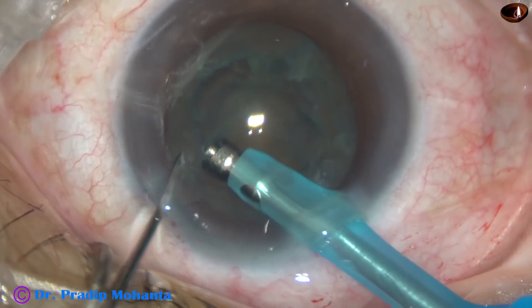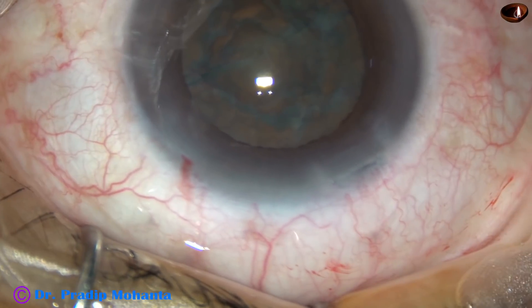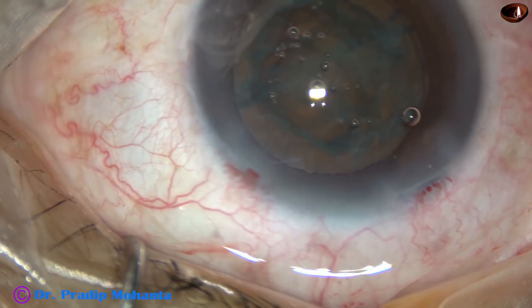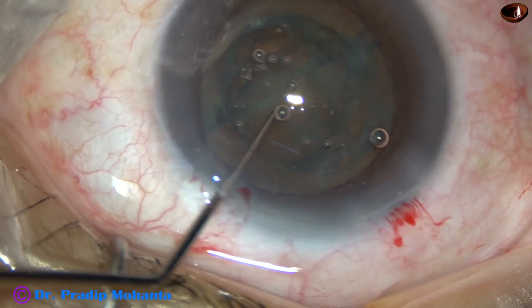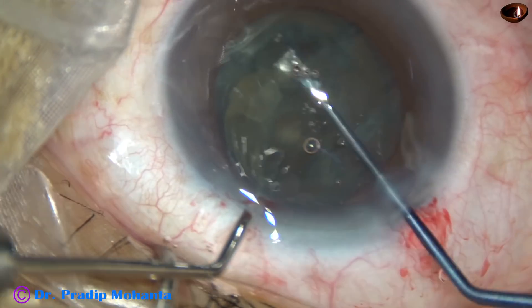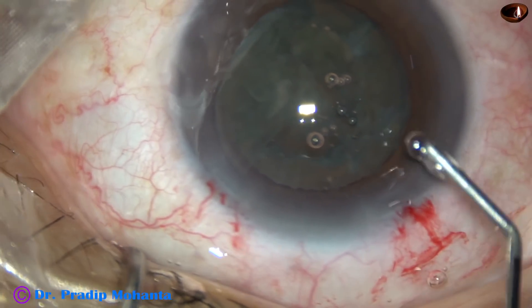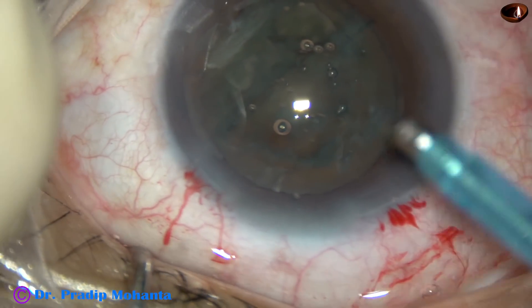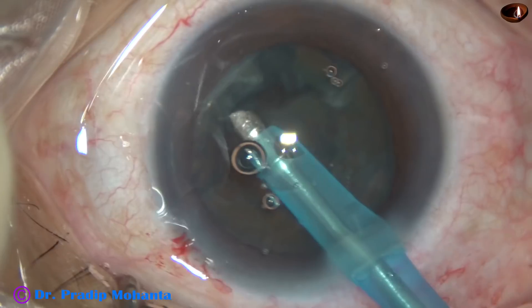What to do now? In such cases, we must not try to catch the soft plate — the remaining soft plate — with vacuum using the tip of the FACO handpiece. We must lift off some lens material with a blunt instrument like this, and then remove this elevated portion of the lens material. Now the tip is introduced again into the anterior chamber, and this portion is emulsified and removed.